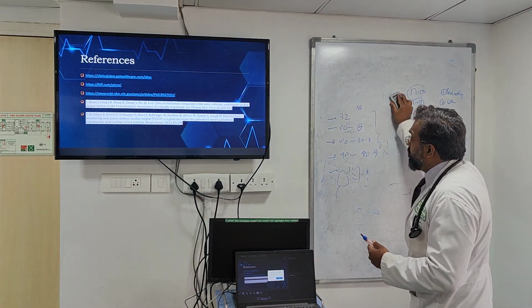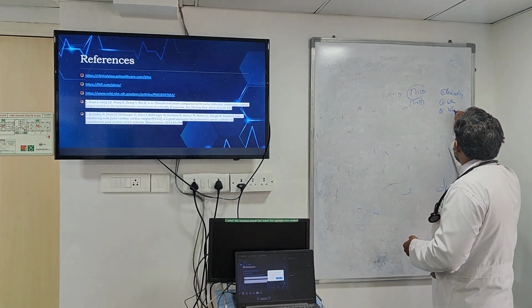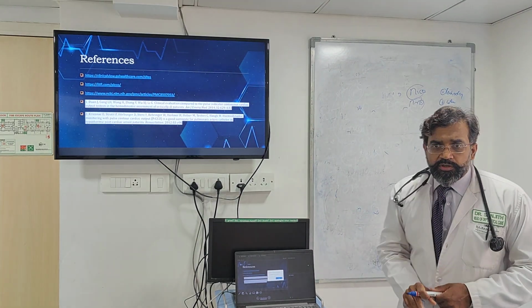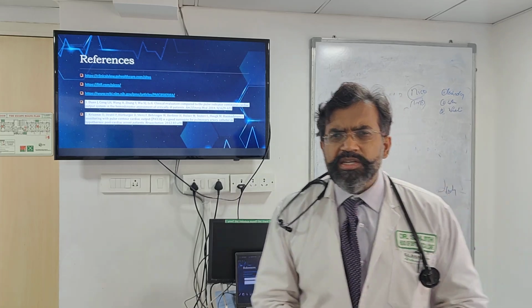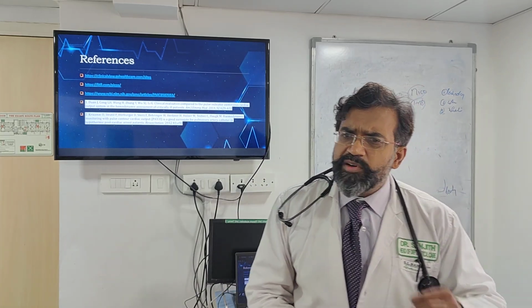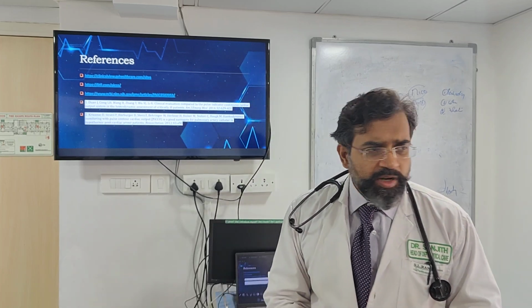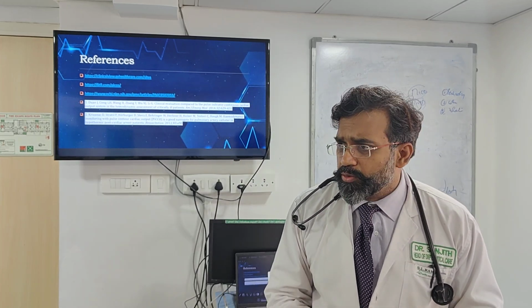Why you would use it. Which are the indications where I would use it? There are multiple indications. I would use it wherever I am having a problem with respect to pulmonary edema. I'll use it wherever there is hypotension. Of course, it's an expensive device. That is primarily the reason we have to be very judicious when we use it.